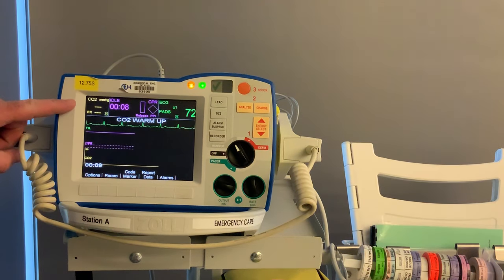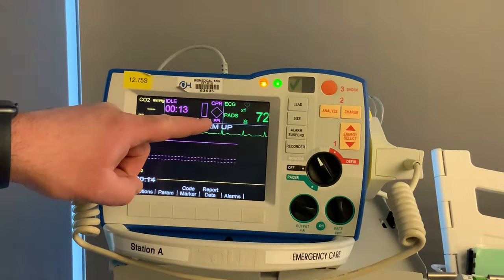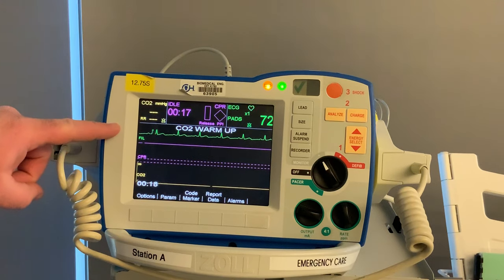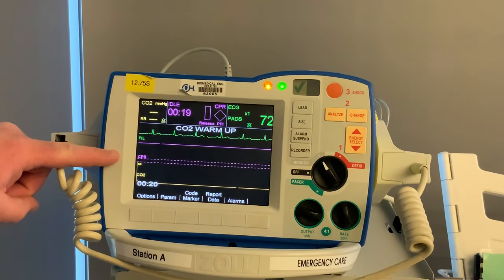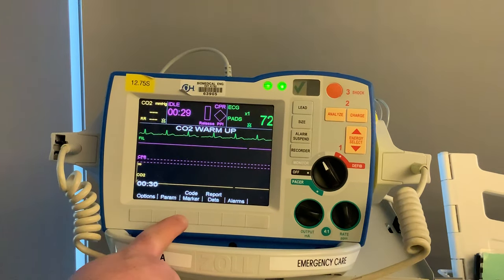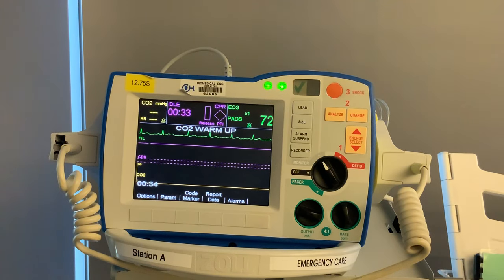Looking at the screen in monitor mode: the top left has your end-tidal CO2, the middle section is your CPR feedback, and the right-hand side shows your heart rate. Your rhythm is displayed below in green. You have CPR feedback in the purple section, and below that, if your patient is intubated on end-tidal, you'll see the end-tidal plot. Underneath that you have your options: parameters, code markers, report data, and alarms.